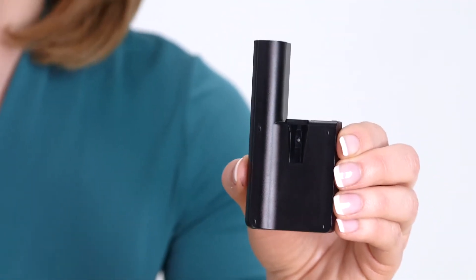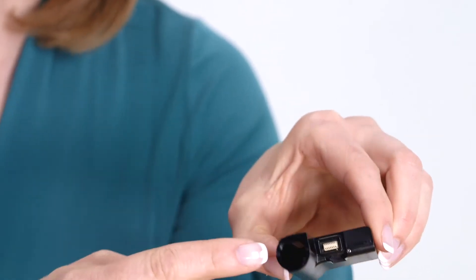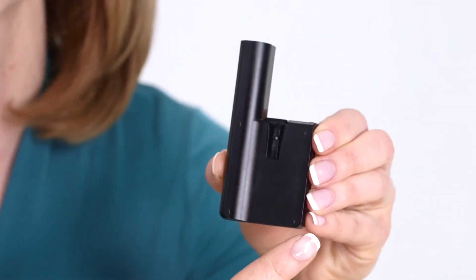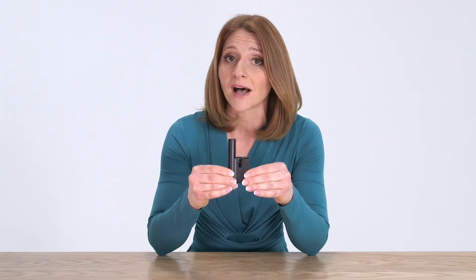This piece here is called the pump body. It contains all the moving parts that will deliver insulin through the tubing. It is designed to last up to one week and it houses a pre-filled insulin cartridge. The pump body also contains its own battery, which means that you never have to change the battery, purchase a new one, or charge the battery. You get a fresh battery each time you change the pump body.